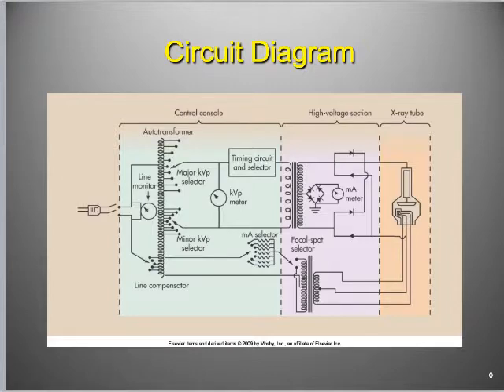Now, one of the very next things it's going to encounter is a line monitor. This is similar to if you've ever looked around the back of your house and seen the little thing that's telling the power company how much money they can charge you for the electricity you're using. It's monitoring the line, seeing how much power is coming into the system, right? That's important because power fluctuates. We've probably all had those weird moments, like what they call a brownout, where the power flickers across the whole city and then comes back online, right?